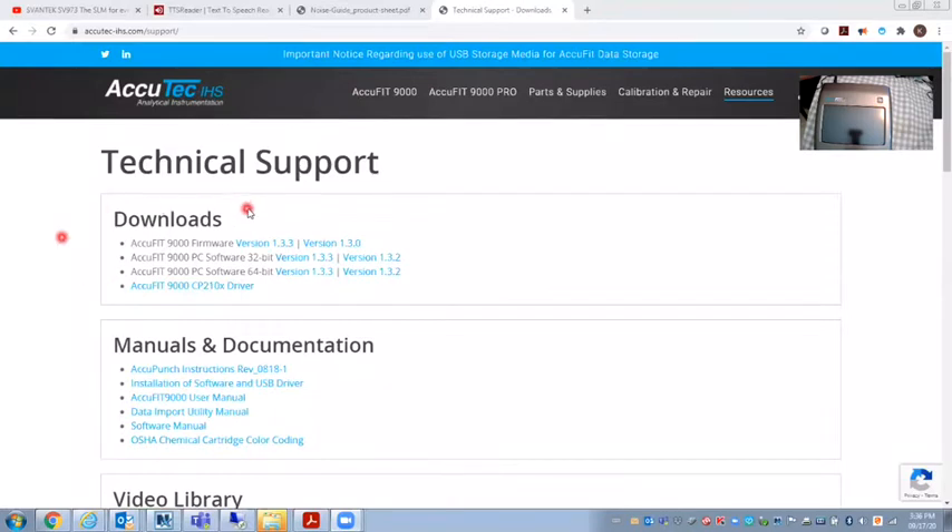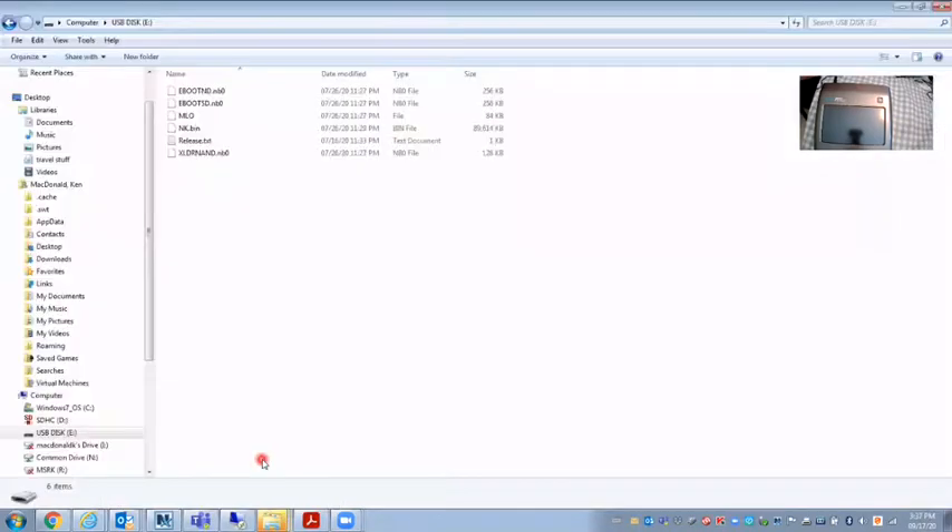I've already downloaded this version. When you download it, it's a zipped file and then you unzip it. What you want to do is put it on a USB drive with no folder — I've unzipped it and placed it onto the drive with no folder. It's in the root directory.